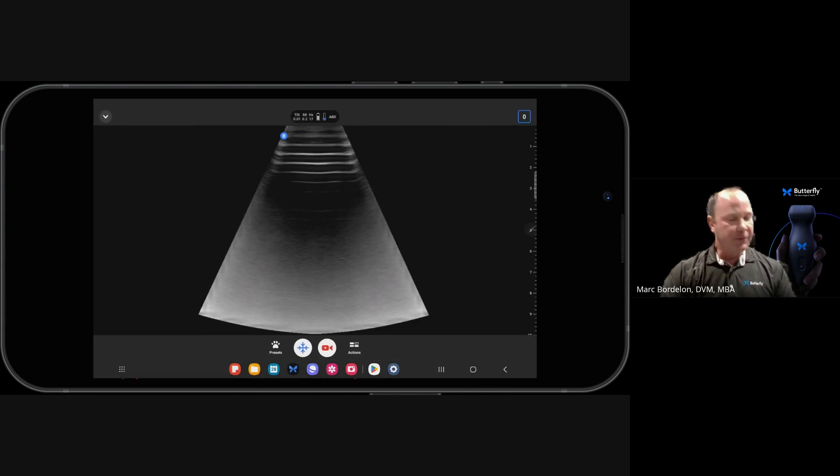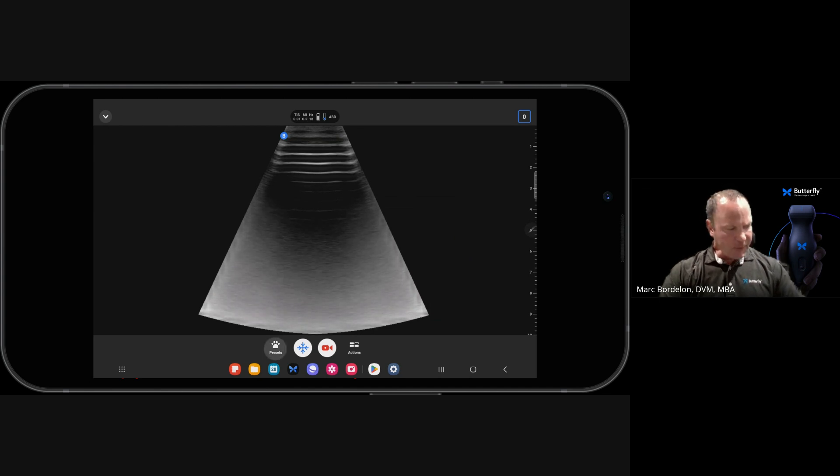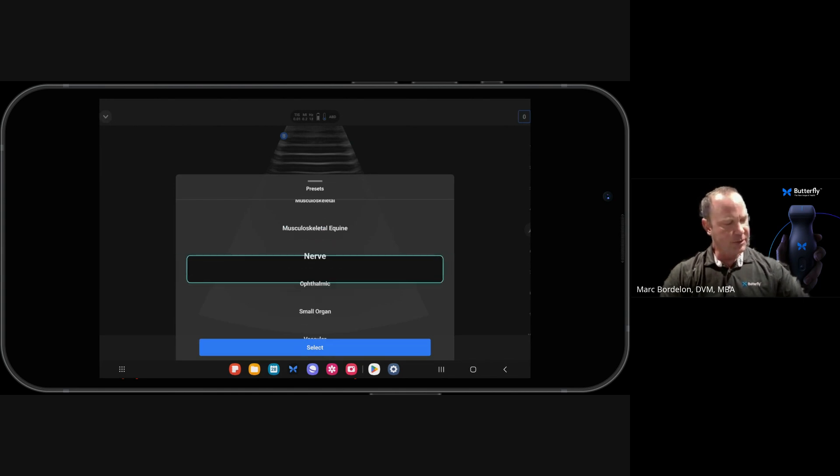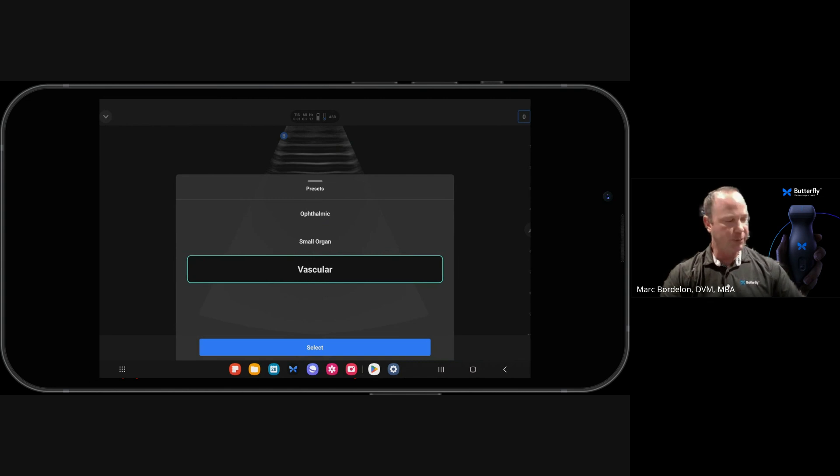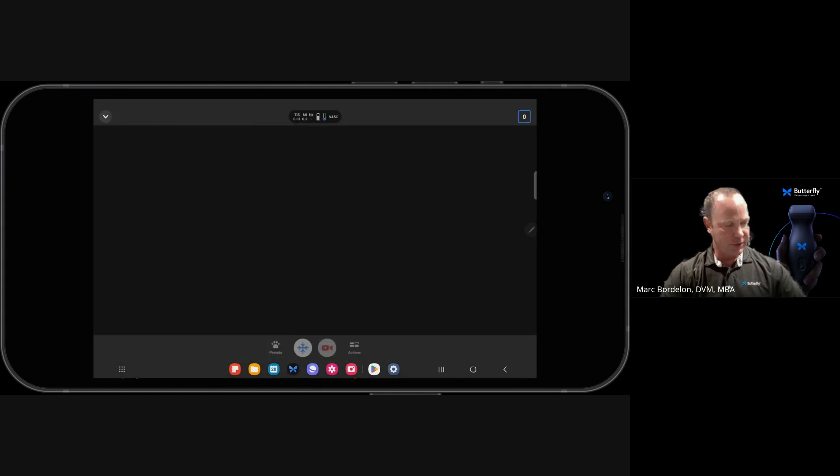So the first thing we're going to do is ensure that we're in the right preset for what we're scanning. In this example, I'm going to be scanning a vascular phantom, so I'm going to select the vascular preset, which is a linear preset. It'll give me more detail for those more superficial structures.